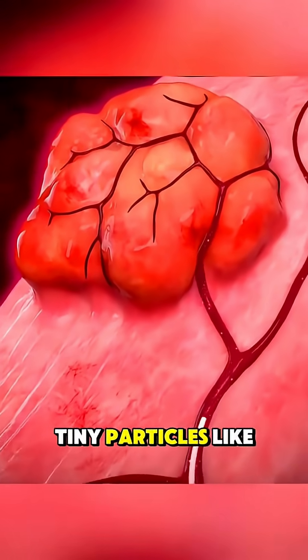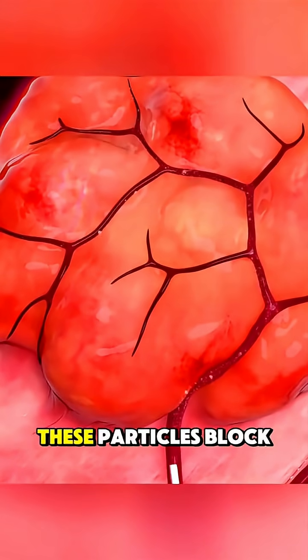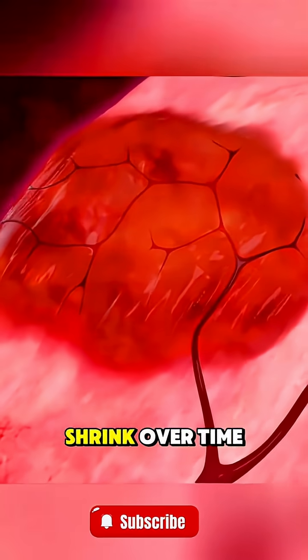Tiny particles, like grains of sand, are then injected through the catheter. These particles block the blood flow to the fibroids, causing them to shrink over time.